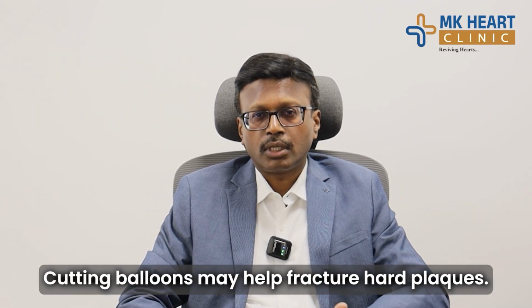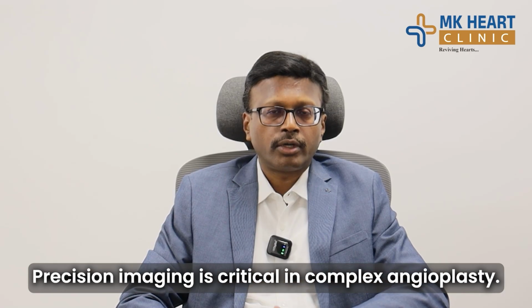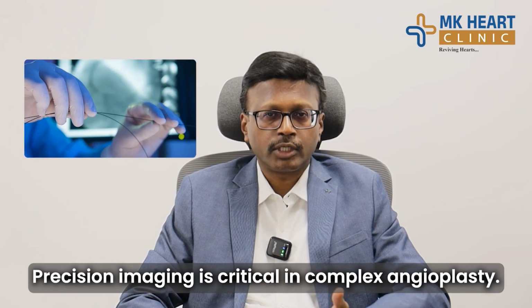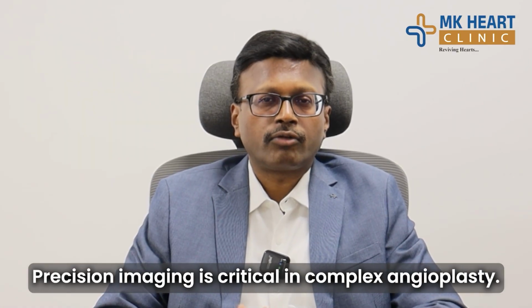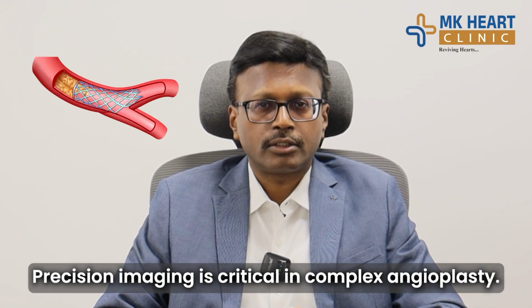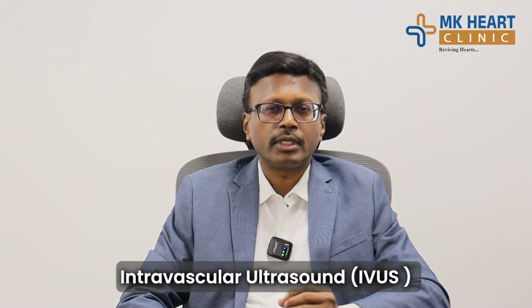Sometimes we will be using the additional tool called the cutting balloon angioplasty. So in calcified lesions, we have to use a specific tool to break the calcium and then implant the stent. In bifurcation lesions, there are different techniques, 2 stent techniques, single stent technique, where we will be using, most importantly, imaging devices.